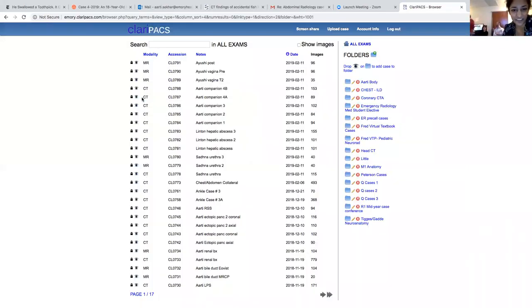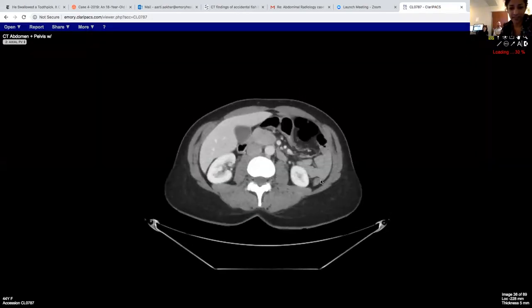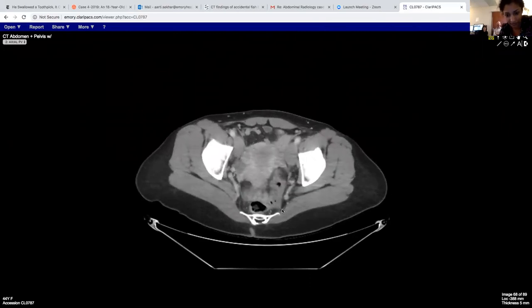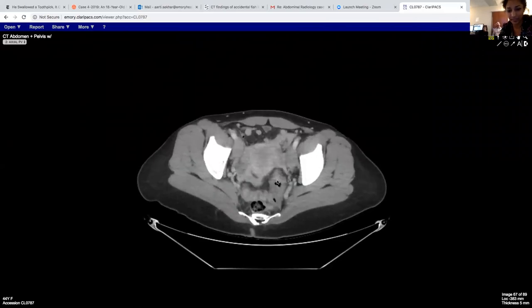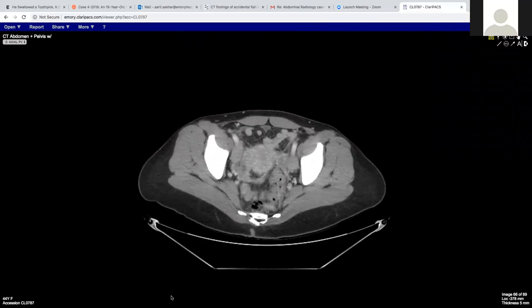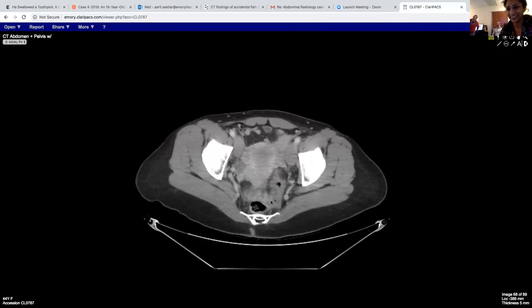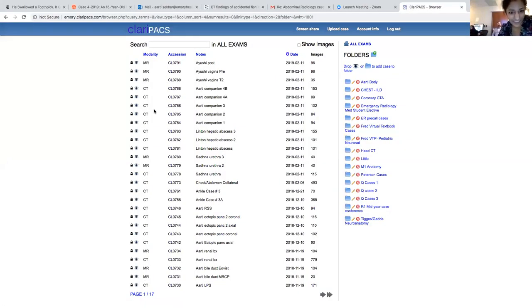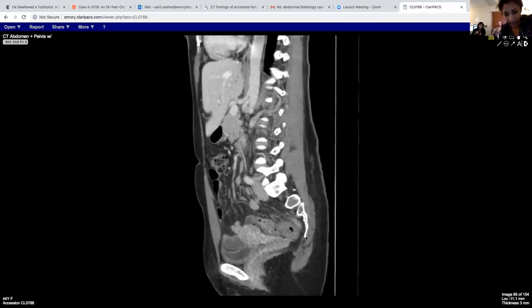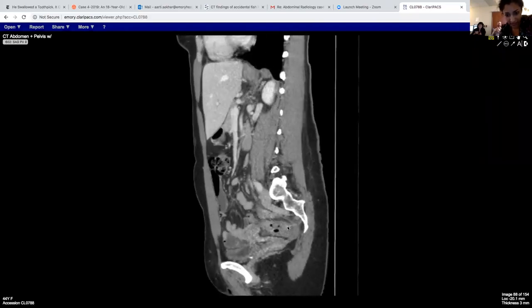And then the final companion is this one, where this is very hard to see — there is a linear structure right here. It's not a fish bone. This was actually a toothpick — well, it's a skewer. It's a wooden skewer that went through the bowel. The wooden ones like chopsticks or skewers are even harder to see — here you can see this linear thing, but they're really not radiopaque.